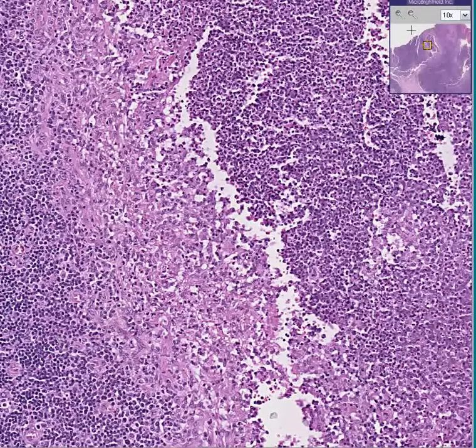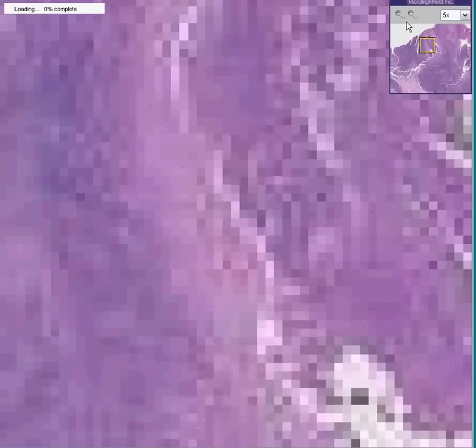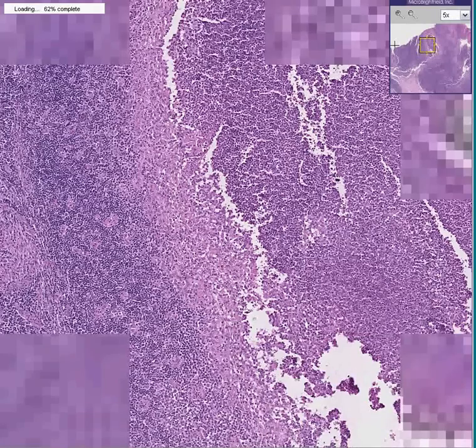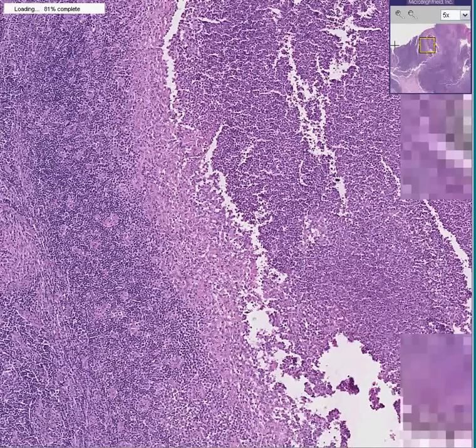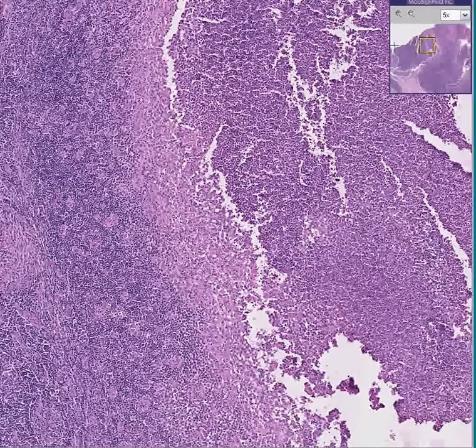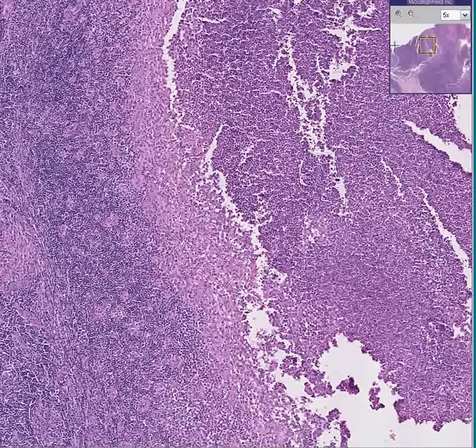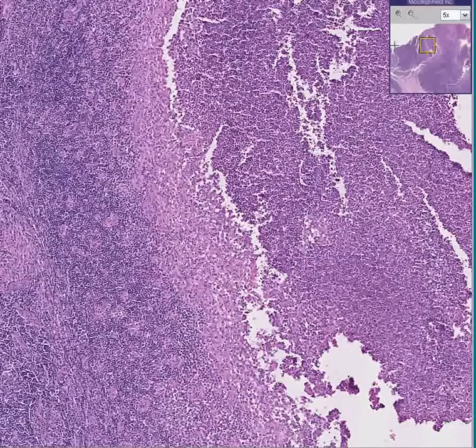This lymph node is another example of centrally necrotic, or caseating, granulomas. Caseating granulomas are TB until proven otherwise. But we've already seen a case of brucellosis which had caseating or centrally necrotic granulomas, and that wasn't TB — that was brucellosis.